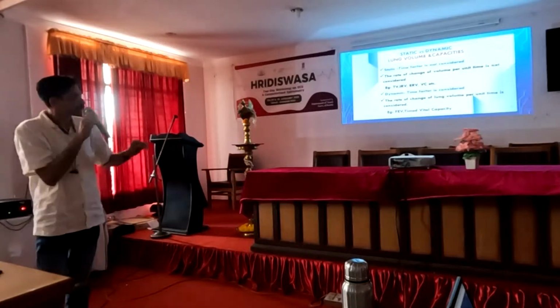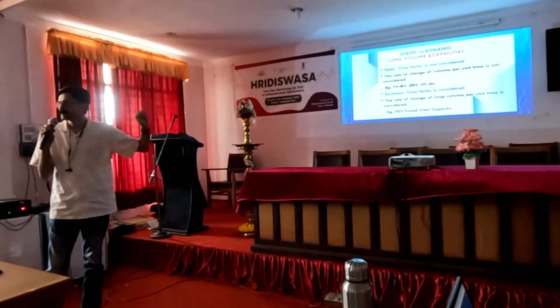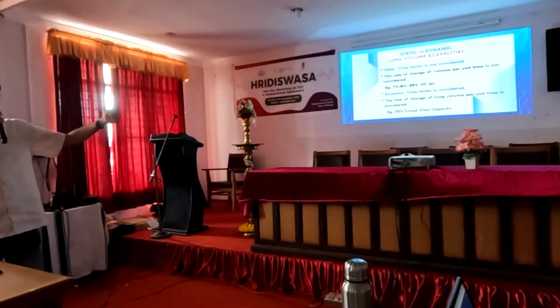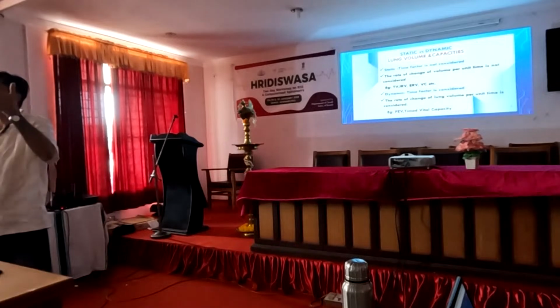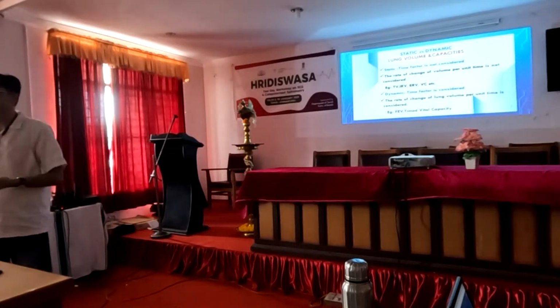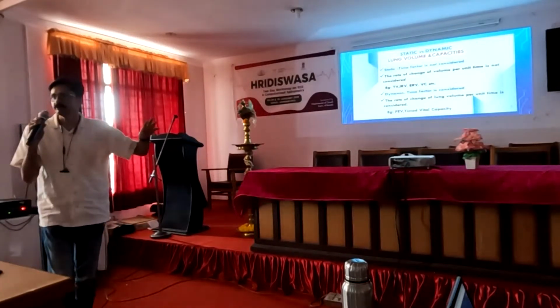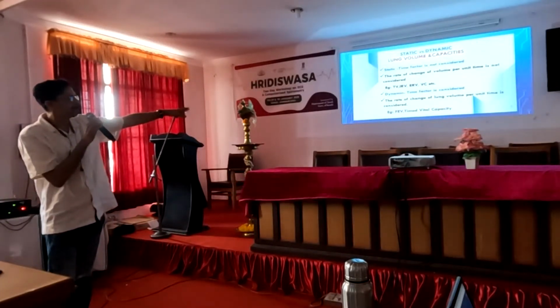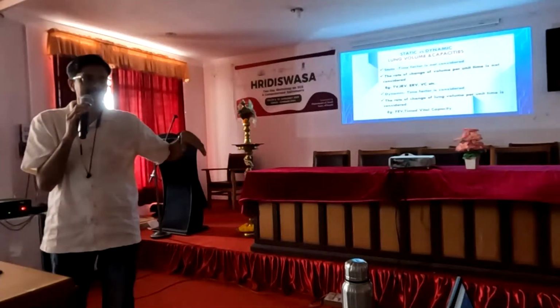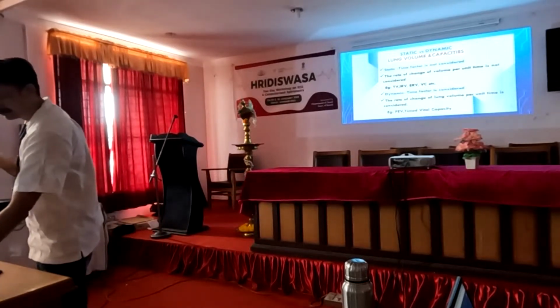Clear? So the normal static lung volume examples are tidal volume, inspiratory reserve volume, and then vital capacity, etc. These are static. We are not considering the time. Just inhaling, according to the instruction, he will take the deep inspiration and deep expiration only. We are not considering the time. That is static. Dynamic is timed, and examples are forced expiratory volume and timed vital capacity. These are all dynamic lung volume and capacity examples.